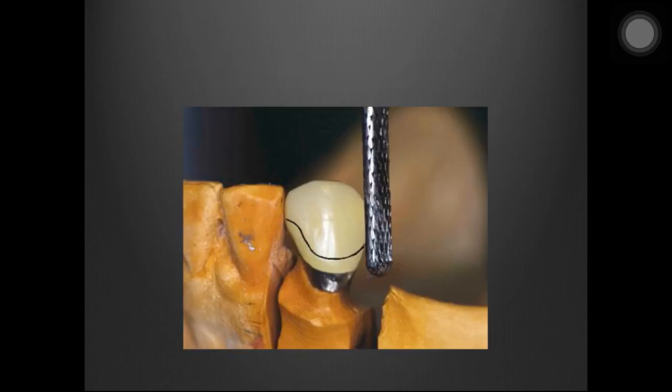Also, another purpose of the surveyor is surveying ceramic veneer crowns. After the crown has been fabricated and porcelain has been applied, the final wall or surface of the tooth to be made parallel to the denture is again made parallel with the help of a surveyor before inserting into the patient's mouth.